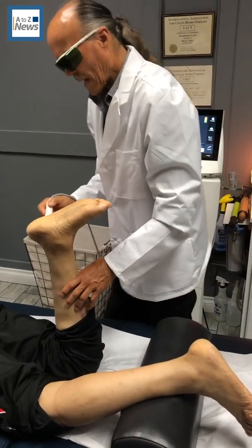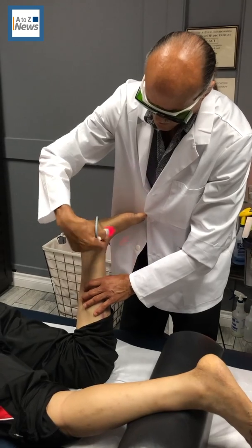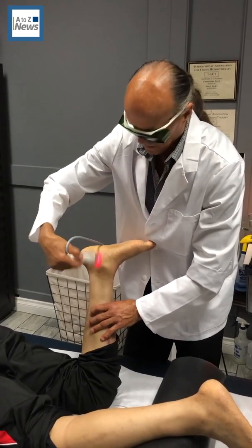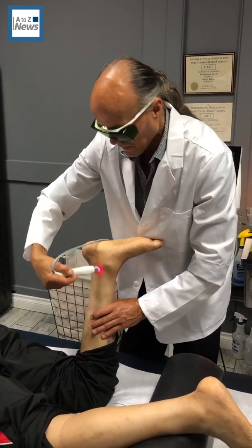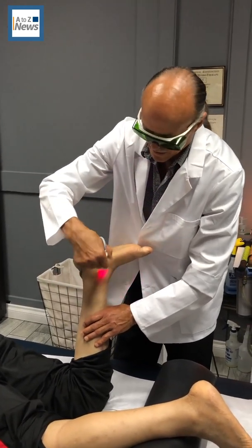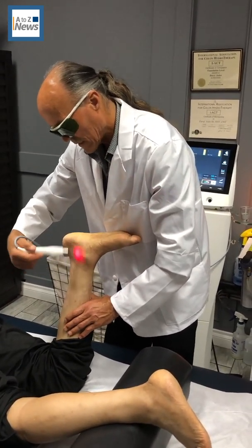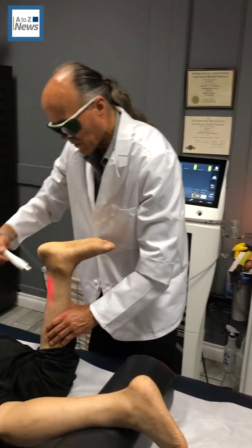It's comforting for the patients — they can handle it. It's never overwhelming; it's soothing. Most patients like it, and they always get a relief effect from their stress or pain in the area of the body that we treat.